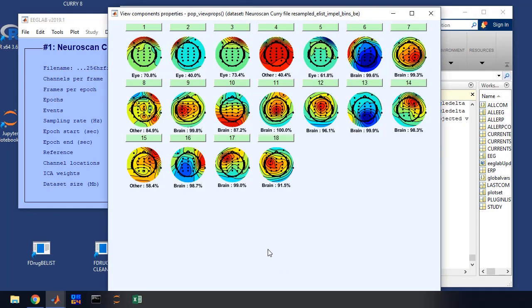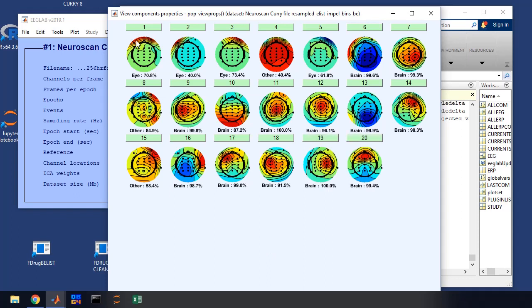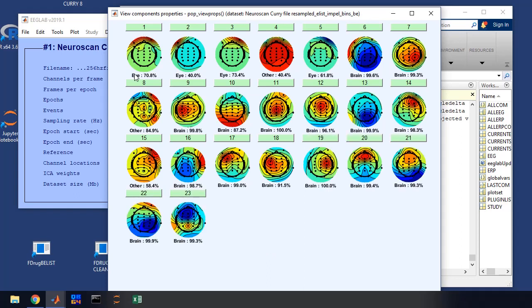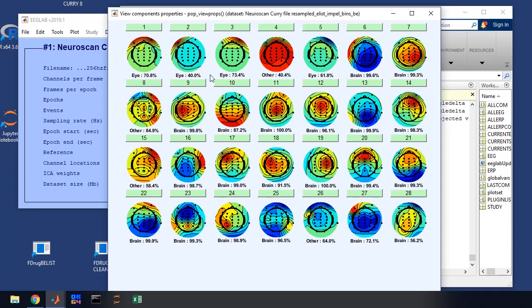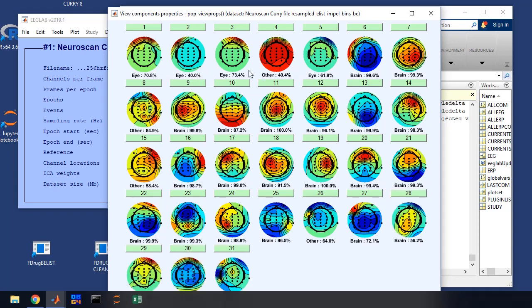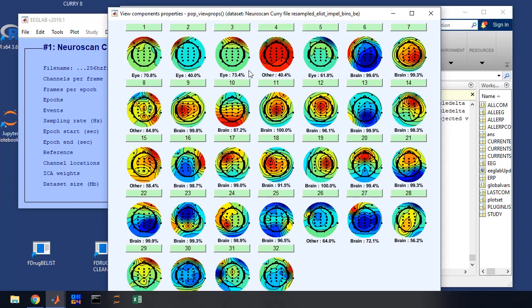And then we're going to get an output window that has maps of our ICA components. And the map, as you will see, has a number and what IC label thinks it is and a percentage associated with that confidence. So what I want you to do is go through and inspect these and see if you agree with IC labels determination here and keep some and reject others. What we're going to do is keep the ones that are brain, reject the others that are other sources of artifact, like ocular activity or some kind of weird movement or channel noise, that kind of thing.